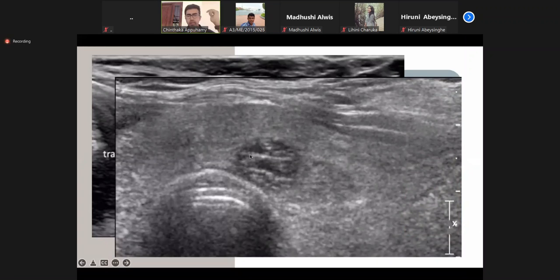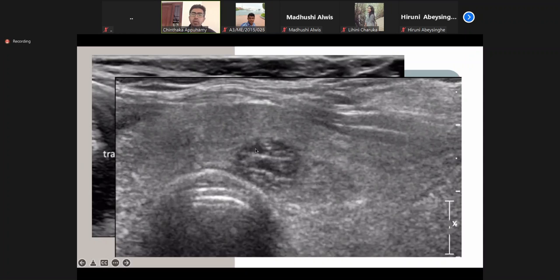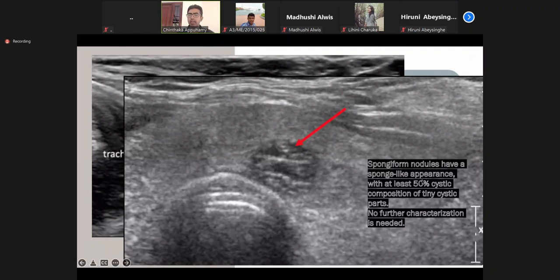Another benign nodule — this is what you call a spongiform pattern. It's like a sponge: there are cystic areas and solid areas in a lace-like pattern. This is actually the commonest nodule we see in daily practice. Spongiform nodules have a sponge-like appearance with at least 50% cystic composition. No further evaluation is needed.